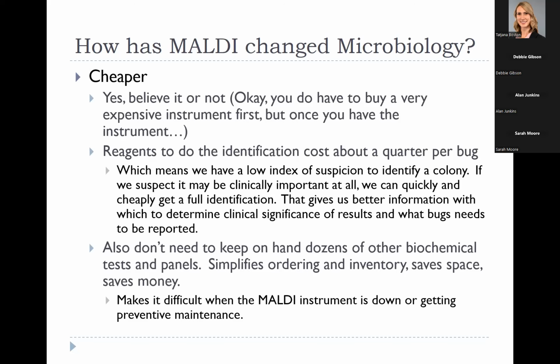You may have had a few academic labs with sequencing ability to identify these bugs, but generally speaking, hospital laboratories were not able to identify any of these bugs by biochemical means. And the problem with that is that you can turn to the literature, but you're not going to find much about these organisms, or you're going to find them called something else because they just got identified as Corynebacterium species or something. So it's kind of hard to find much information about some of these organisms.